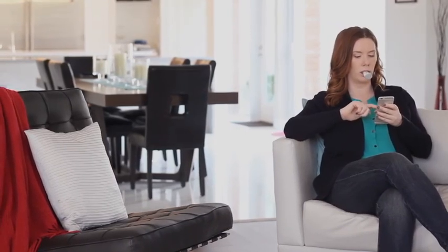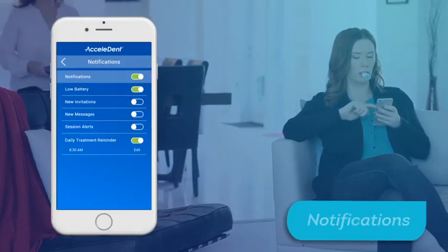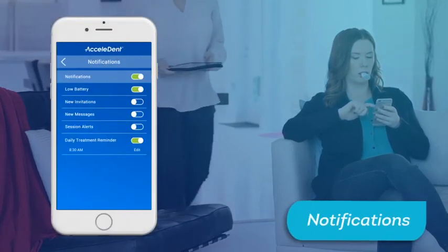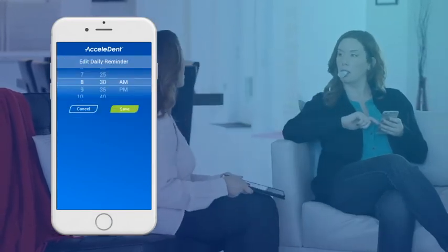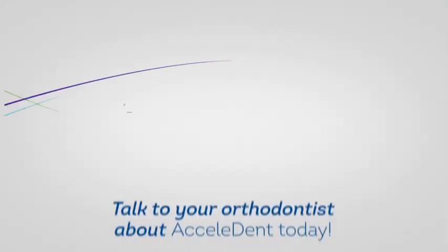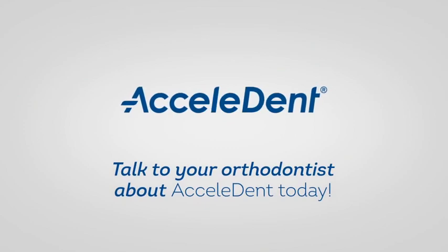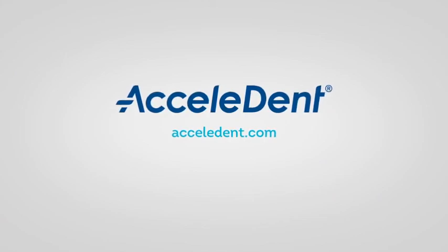To set up a daily reminder in your Accelident app, navigate to the Support tab in your app and tap on Notifications. Make sure your notifications are on and select your preferred treatment reminder time. You will then receive a push notification every day at this time, even if your app is turned off. For more information, please contact your orthodontist or visit Accelident.com. Thank you for trusting Accelident to partner in your accelerated orthodontic journey.